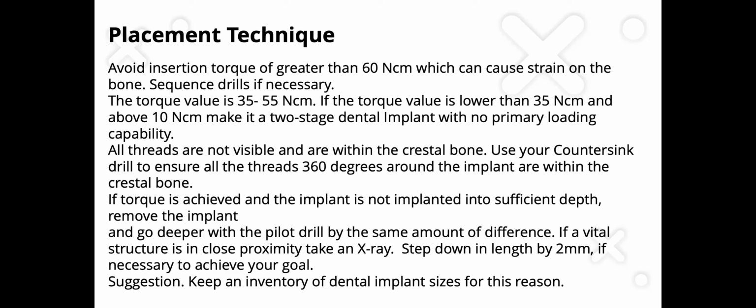And again, another suggestion that we can make on behalf of OCO Biomedical is keep an inventory of dental implant sizes available for you in case you change your mind. You'll be able to establish the dental implant that you're working with as soon as you get in with your osteotomy former. Feel for that quality of bone, understand the different densities tactilely.